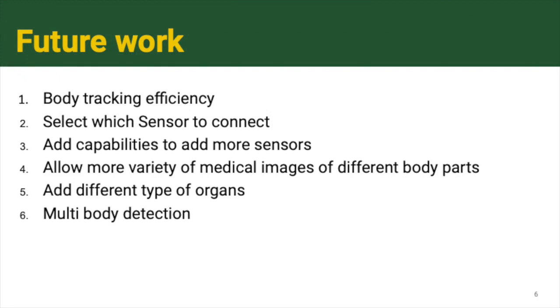This app can be extended for many other use cases. I'll firstly go over the future work that can be done for the current use case before branching out to different use cases of the app that our client suggested. Currently, the 3D heart and the medical image will be attached to the user's body even if the user moves or the camera moves, but there's a slight delay on the updating of the medical image. This error is more prevalent when the patient or the camera moves faster and the tracking will not be as efficient. Hence, this can be further developed to be able to track bodies more efficiently when there's greater movement.